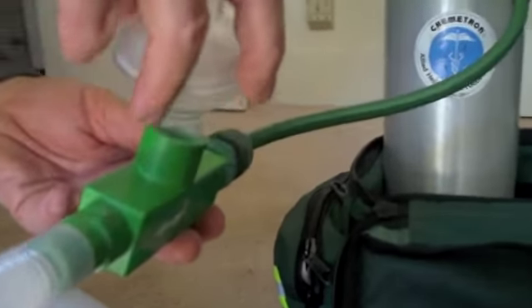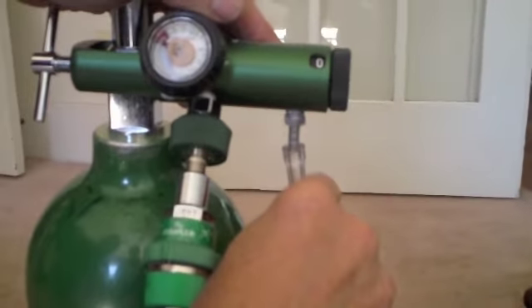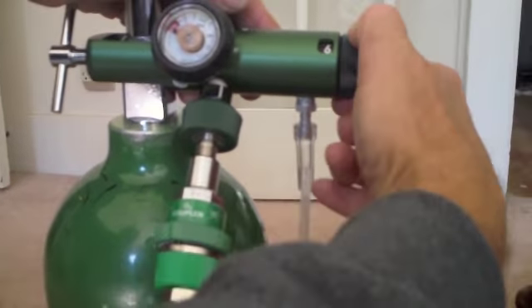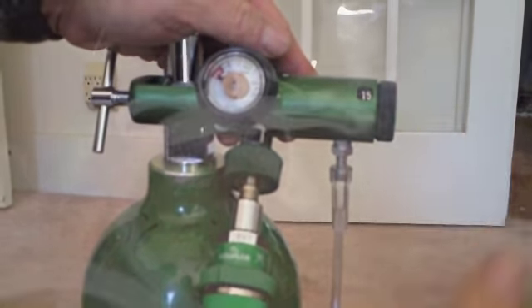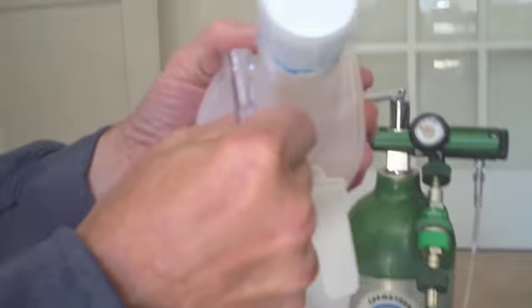For dusty or smoky environments, apply the filter. If more than 30% FiO2 is required, an oxygen tube can be placed on the oxygen valve and then attached to the CPAP face mask. At 15 liters, 60% FiO2 will be supplied to the patient.